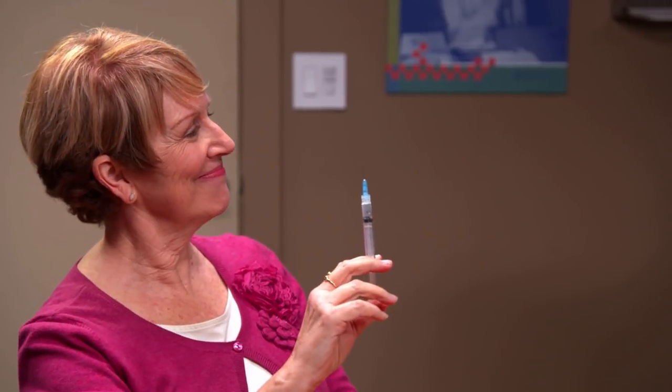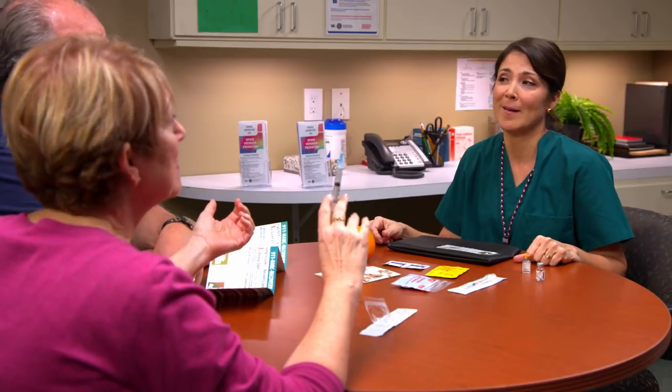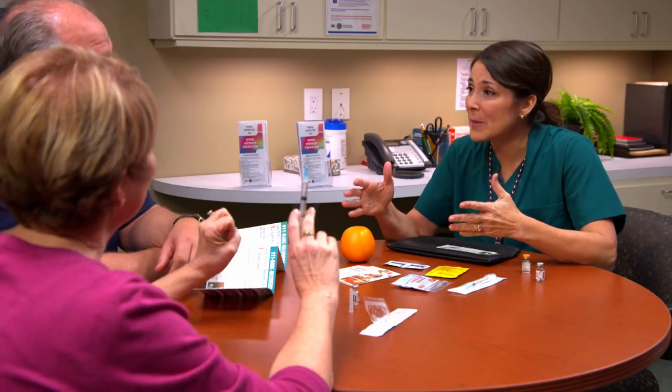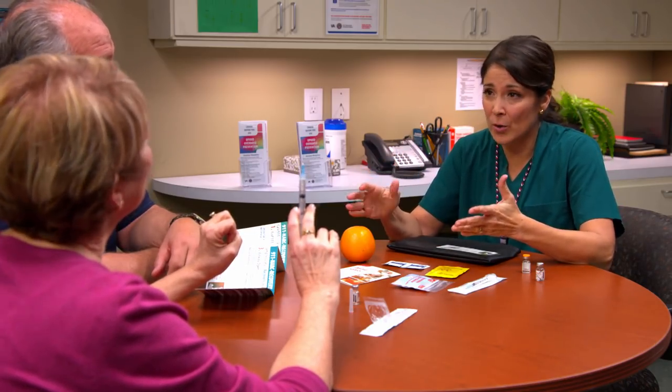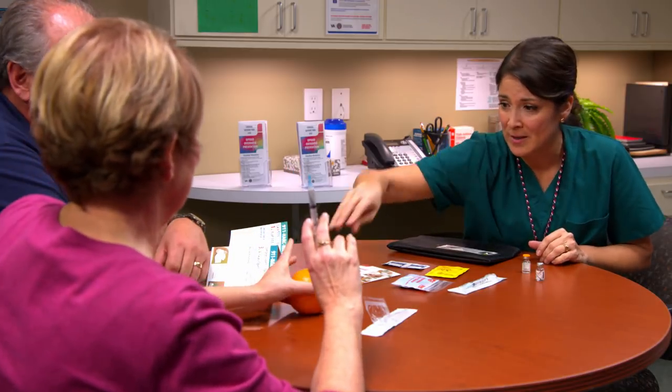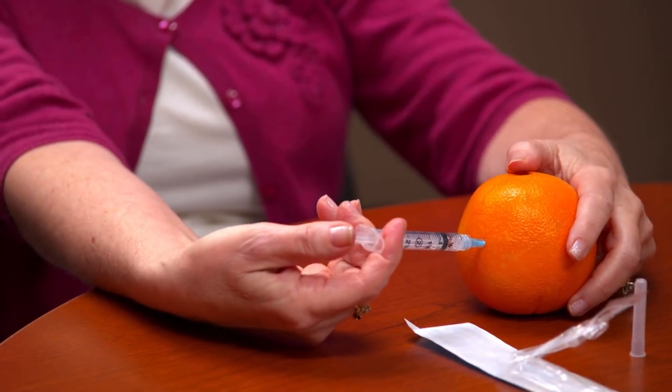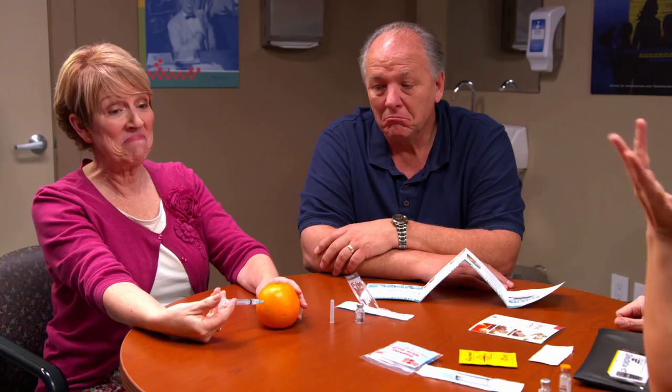Where's the best injection site? You want a large muscle — ideally the upper arm or upper thigh, or the outer side of either buttock. I want the arm. I'm saving your life, you don't get a vote. And the needle should be 90 degrees from the skin. So let me see you inject this orange. Let's practice on the orange. You're going to go in at 90 degrees. Very nice.